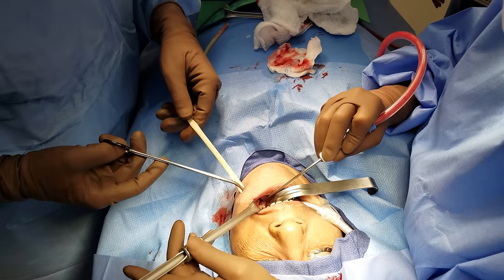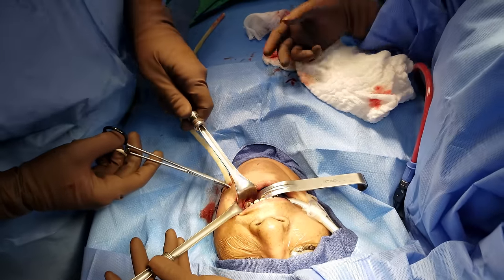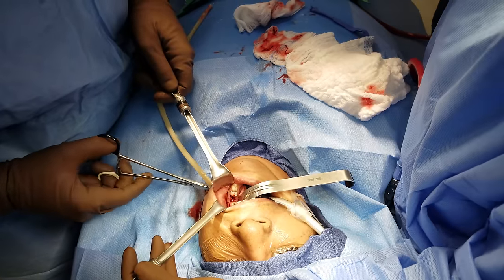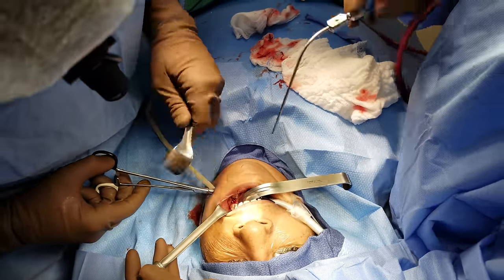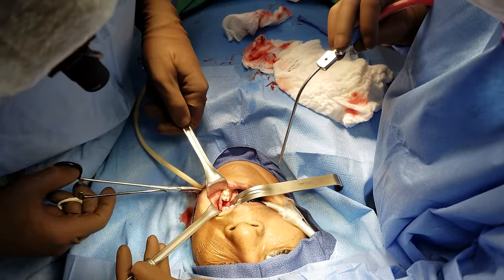Okay. We're going to put our Penrose drain in. And let me use a better retractor. Where's that? Here it is. Okay. Pull back on that lip. Yeah, you can actually see it coming through here. We're going to leave it about right at the gum, if I can get it to stay. Let's see if I push up on it. Man, that's a good position.